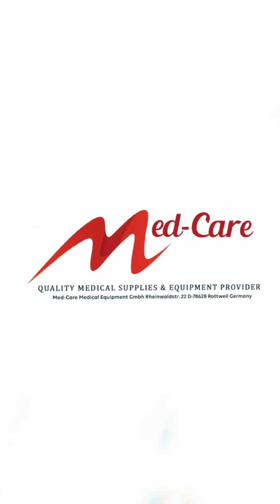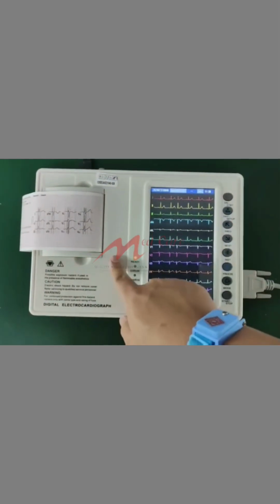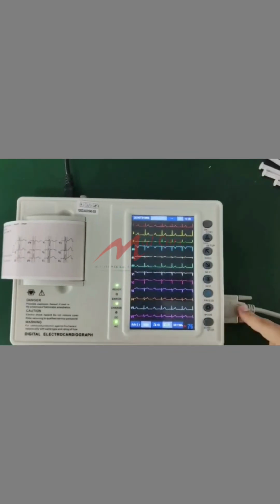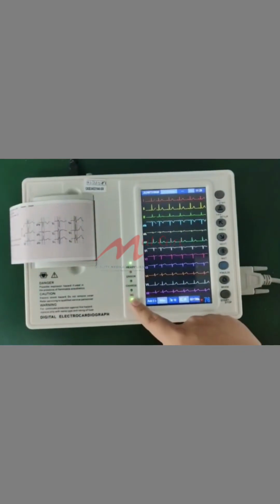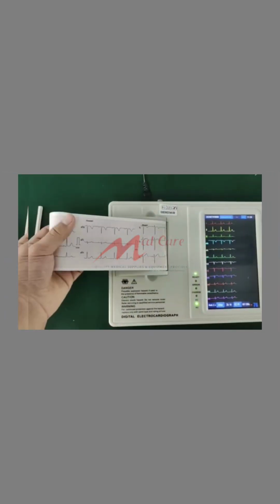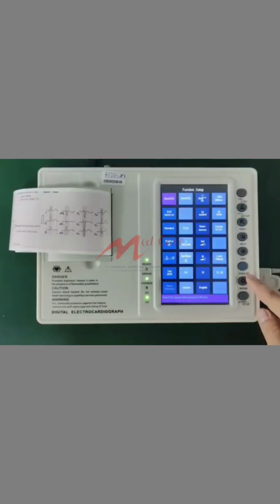Online demonstration. ECG machine. Load the printer, then connect AC/DC power. Wait for the electrocardiograph to stabilize, then proceed to print. After printing, go to the setting and select calibration.